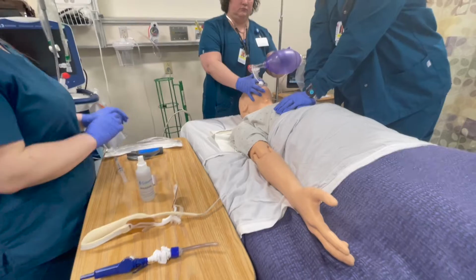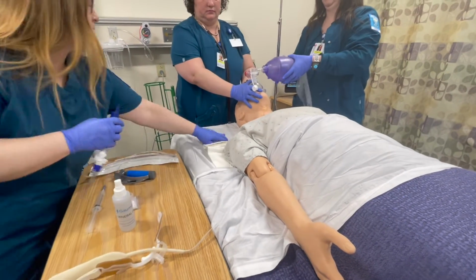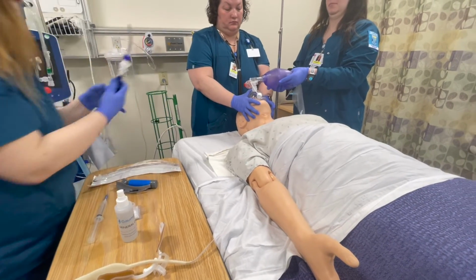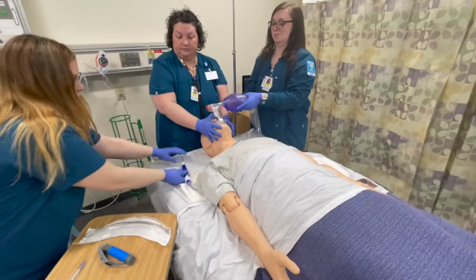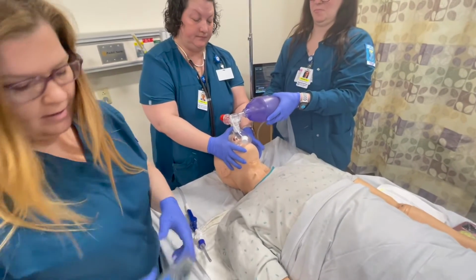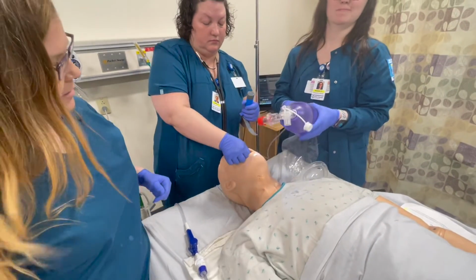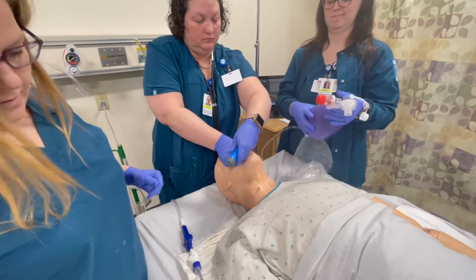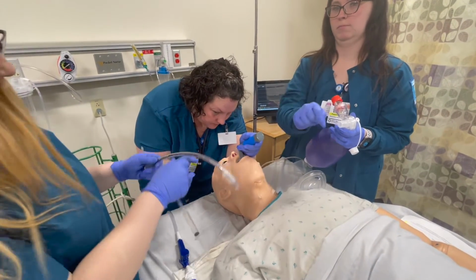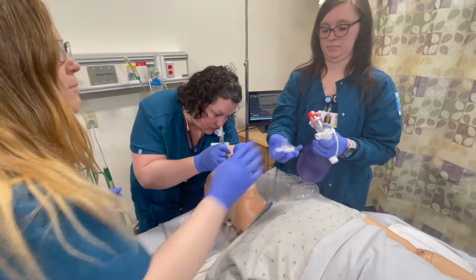Okay. Can you take over bagging, please? Go ahead and set up my suction. Okay. Suction works. All right. Okay. Blade, please. Blade. Tube. Would you please put it on the bag?